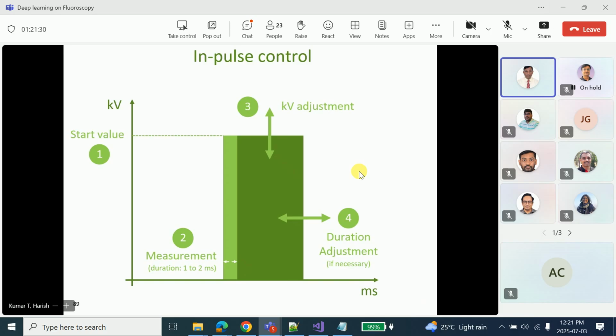For example, say you have injected a contrast. You are able to see there is a pathology, and you want to capture that particular moment. When you switch to capture, it lags 2 seconds, and you miss that contrast, the actual image. What do you have to do? You have to redo the procedure, the complete contrast. The dose is more to the patient. All this is in a fraction of seconds.